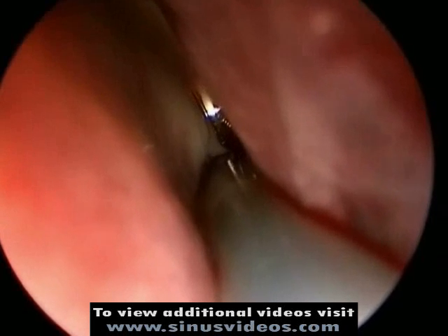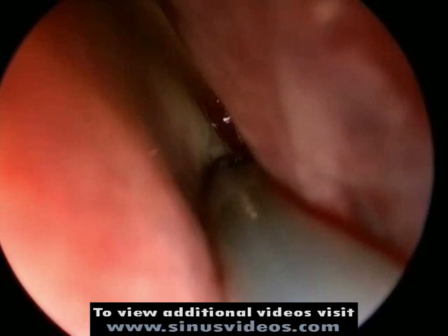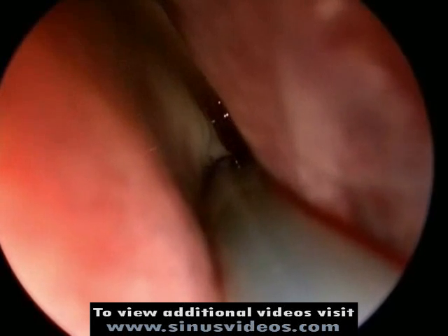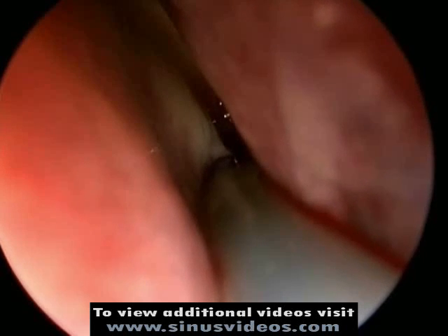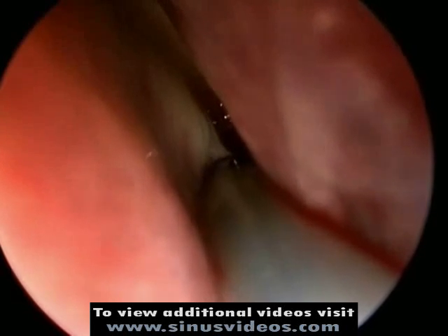The fact that the guide wire enters the sphenoid sinus can be verified by turning off the endoscope light, leaving on the light which illuminates the guide wire tip.